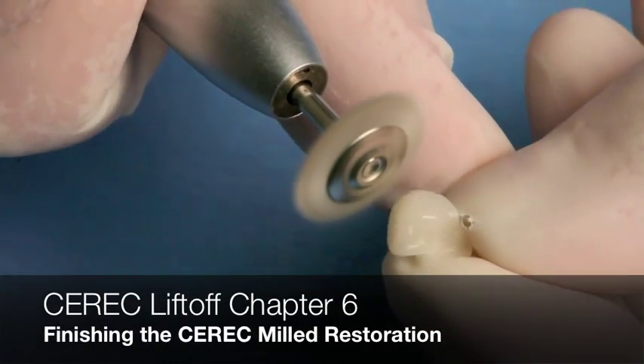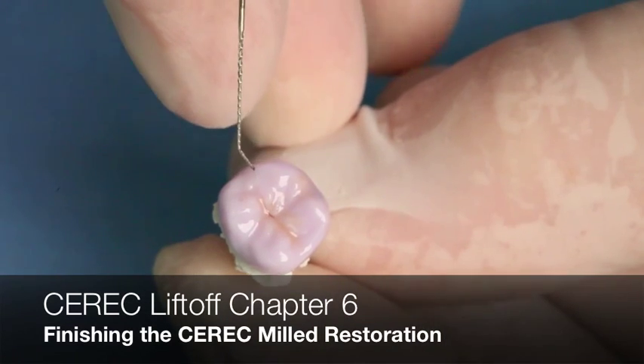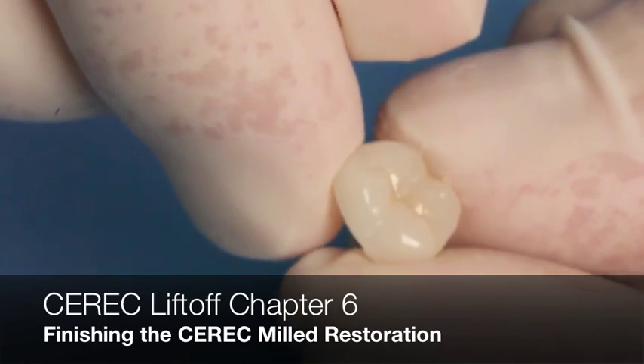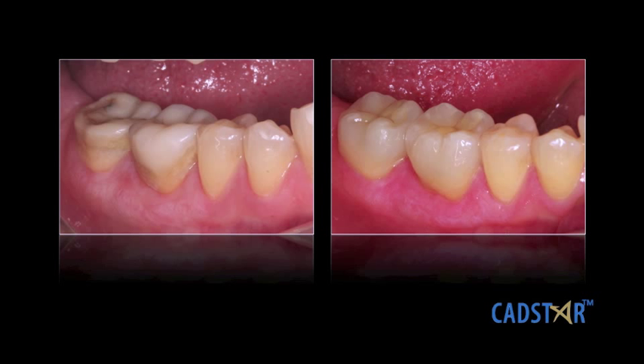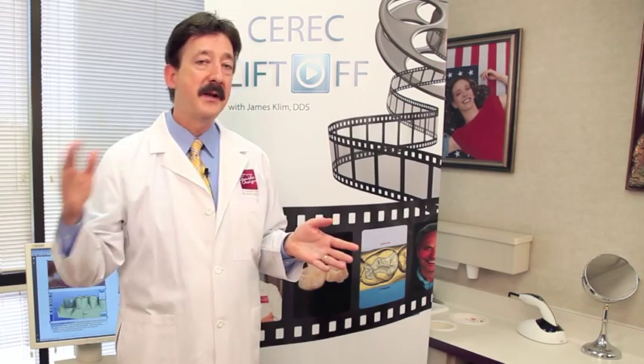Chapter six is the finishing process — whether we're polishing, staining and glazing, or using e.max. It's all there. Chapter six in itself would be worth the cost — or maybe I should say investment — of CEREC Liftoff, because that's where you take it from a C to an A. The restorations look great out of the unit, and how you finish them shouldn't take a lot of time if you know the steps.